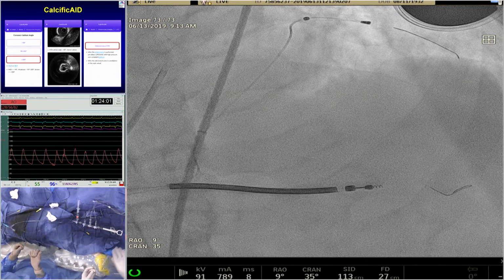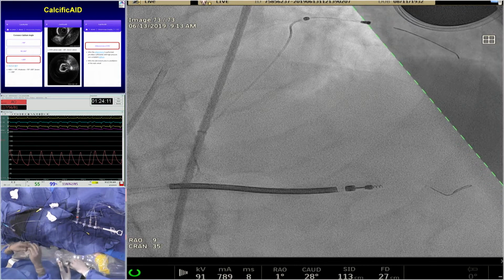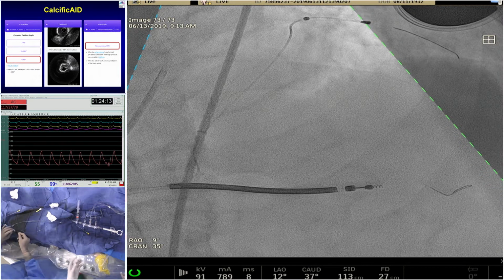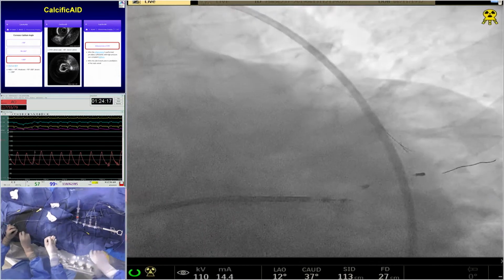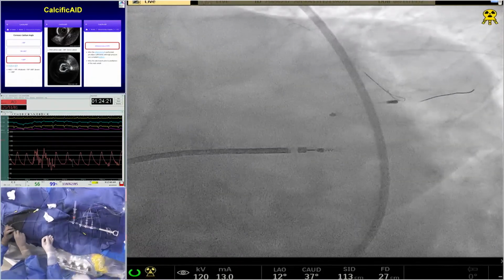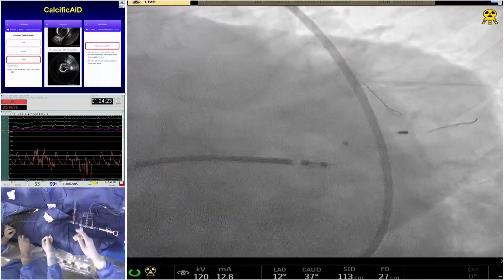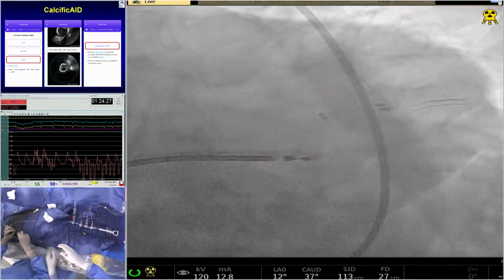My question will be a different way: why would you not do the double stent? Maybe people can give a very quick, brief one-liner opinion on what is against doing a 2-stent approach in this particular case, which has a good distal left main 1-1-1. It's a great question. I'm going to start in the back, and Yves Louvard will speak last, since he's the only one who wants to do provisional work here. But Manish, and then let's just move down.